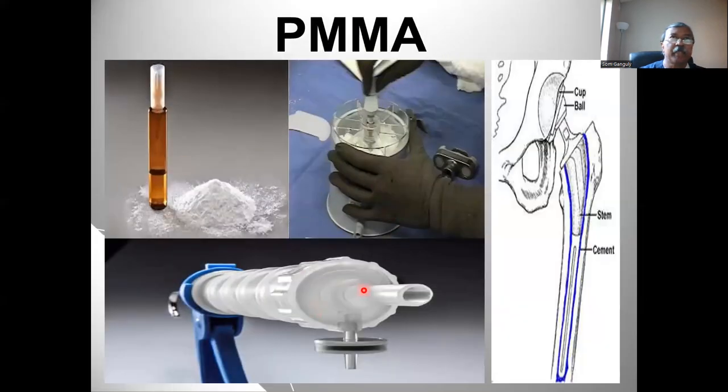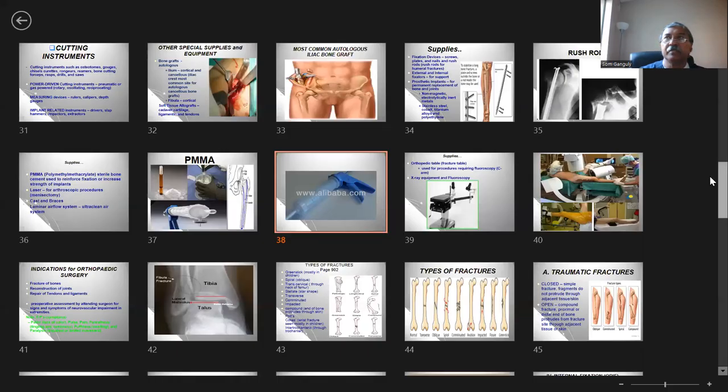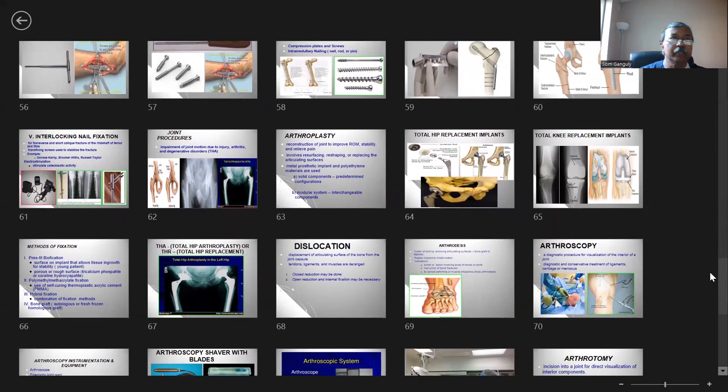It is mixed on our back table. Then we pour this glue-like polymethyl methacrylate inside this cement gun. And with this long nozzle, it can fill the gap of the intramedullary cavity. When it does that, with the use of this type of cement gun, we have cement in place inside of the medullary cavity.